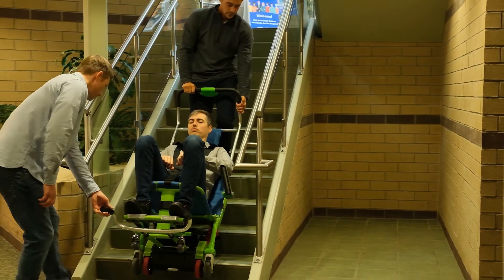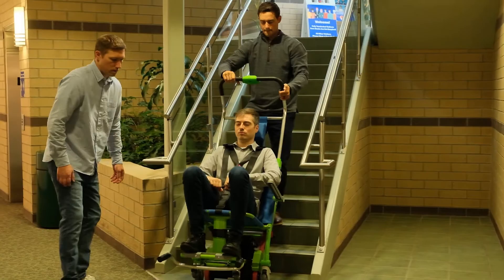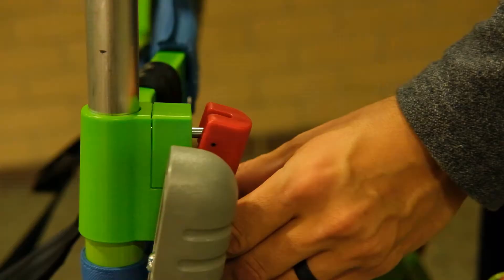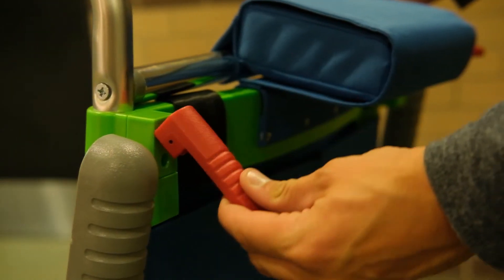No matter which direction you are moving, once you have reached the ground floor, maneuver to the final exit. To return the chair to storage, engage the brake mechanism by placing your foot on top of the red footpad and pressing down. Undo the red spring clips on the handle, gently lower the handle, and close the spring clips.